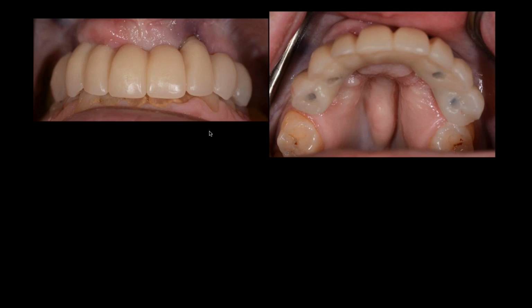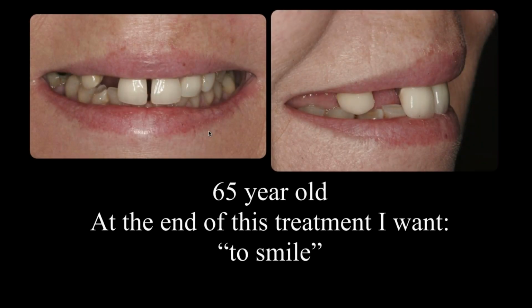So I took the plan, and then I went higher than that to make sure I knew where the height of the platforms needed to be. And I wouldn't know any of that unless I did this. Otherwise, you'd be more superficial, which would be bad. So let me finish up on this case because we're almost at 45 minutes.